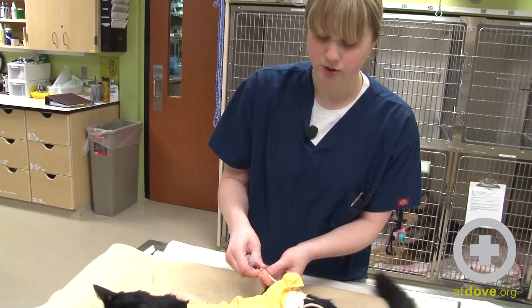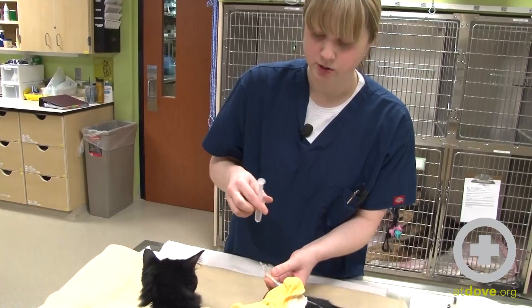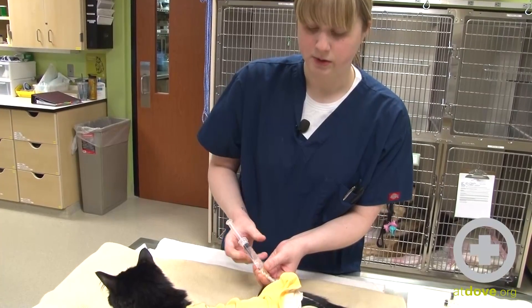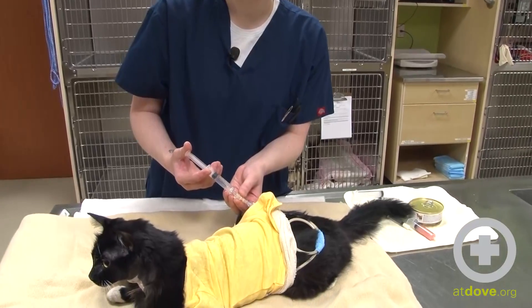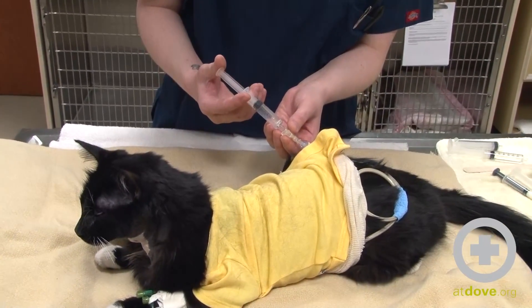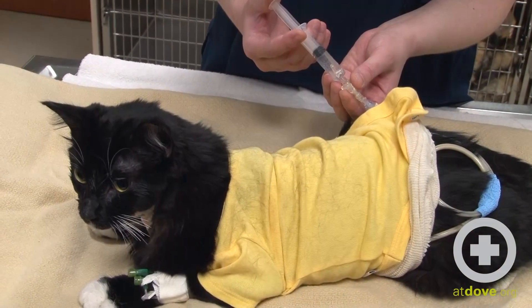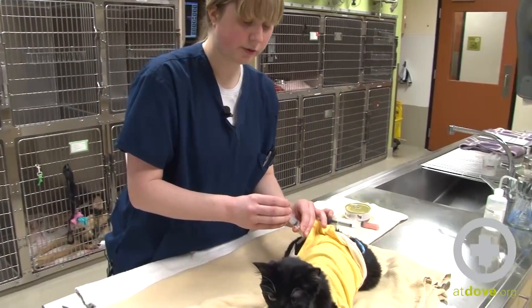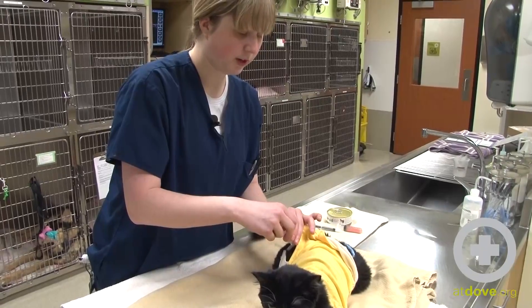What I'm going to do is go ahead and flush some water in first to clear the tube and make sure that she's okay with the contents hitting her stomach. I want to watch her for signs of gagging, any kind of distress, anything that shows she's not reacting well to the feedings. She didn't show any sort of reaction for that, so I feel comfortable continuing with a feeding here.